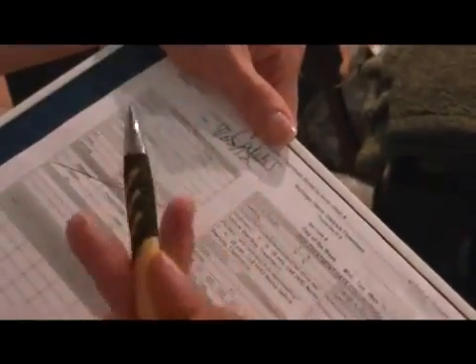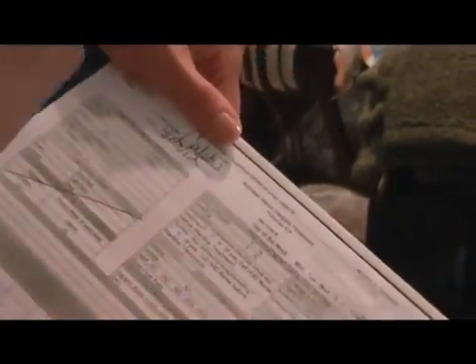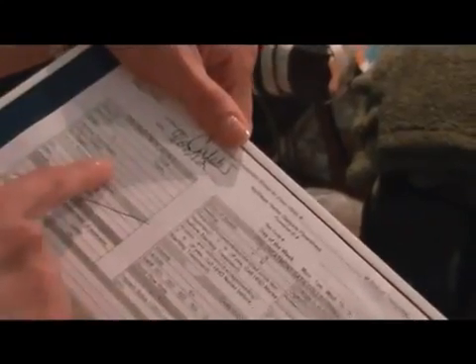How you know how much fluid you're actually going to take off is we have a dry weight, which his is 80.5 kilograms. And so he weighs himself. We write down what it is, subtract the dry weight, and then that's how much fluid we set the machine to take off, and we write that all down right here.